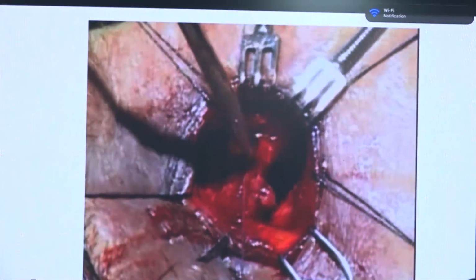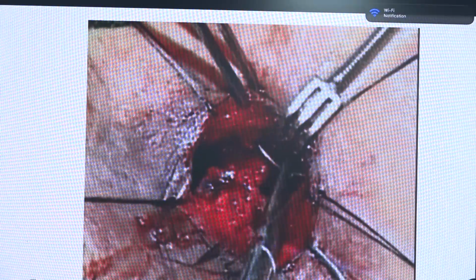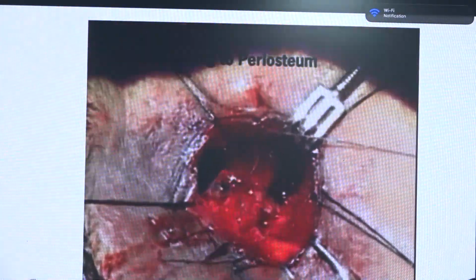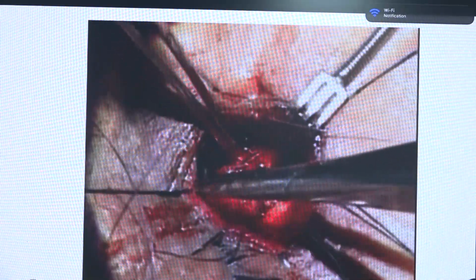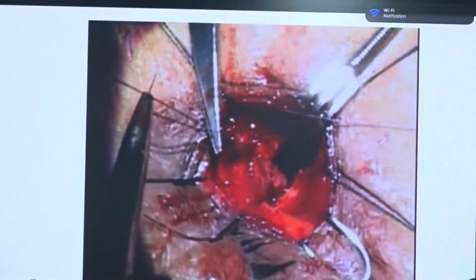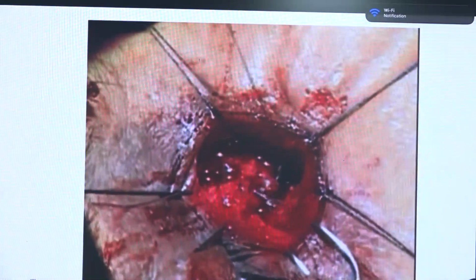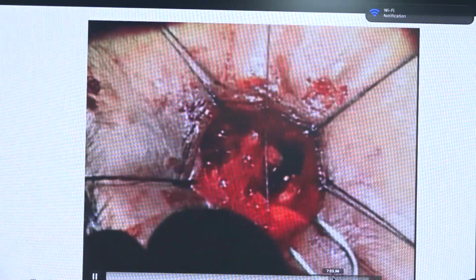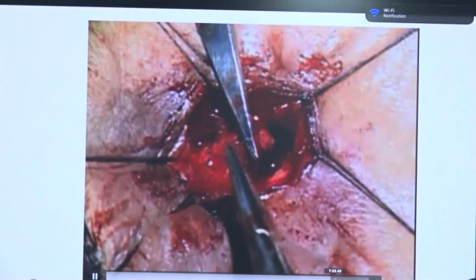This is the first suture that is being tied. It is then anchored anteriorly, preferably to the periosteum, so as not to allow the flaps to fall back. After the middle suture, 2 similar sutures are placed more superiorly and inferiorly. The flap suturing is thus complete.